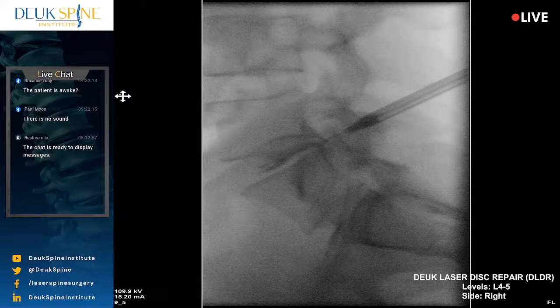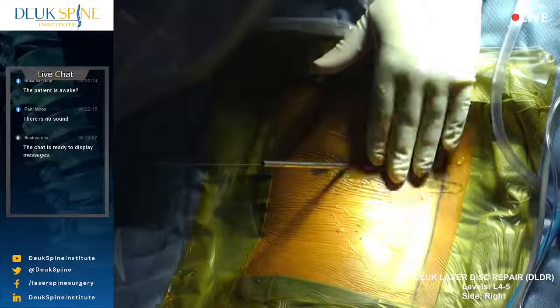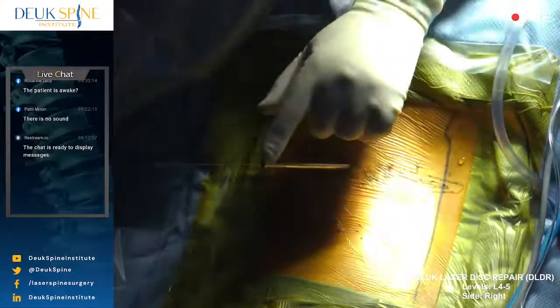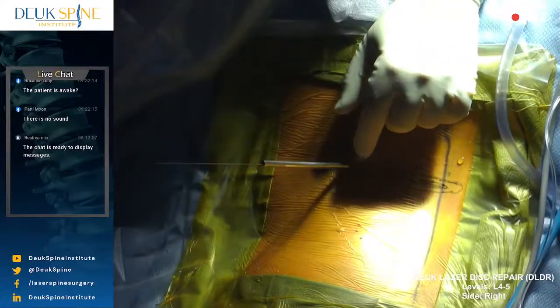Let me just retest. All right, so we're going to do the whole surgery through a little cut. And again, we're not damaging anything inside. All the normal tissues we're leaving. So how is that possible? If you look at the tube that's going in, this dilator, it actually has a tapered end.